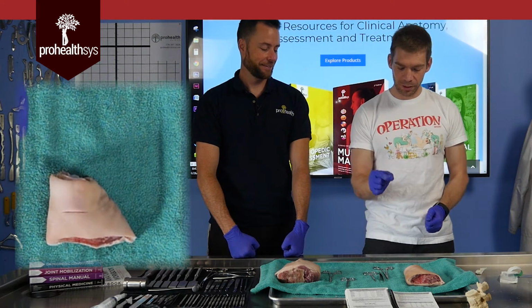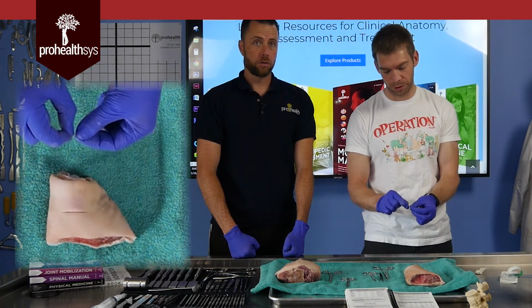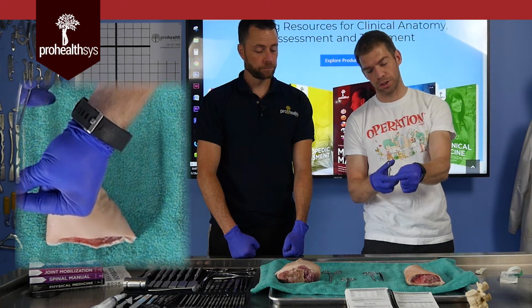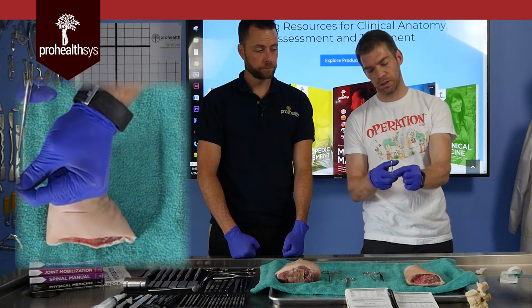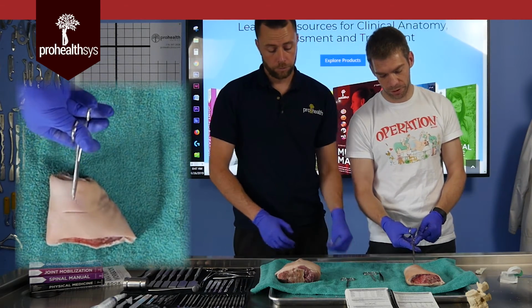So the next thing, I'm going to put this needle where I know exactly where I'm going to put it. These are hard to see, so maybe I'll just load this up with my needle driver for optimal safety. Note, again, not touching the tip, not touching the pointy part. I'm going to grab, and this is called loading your needle driver. Let's put it down here over top of the contrast, the pig skin.